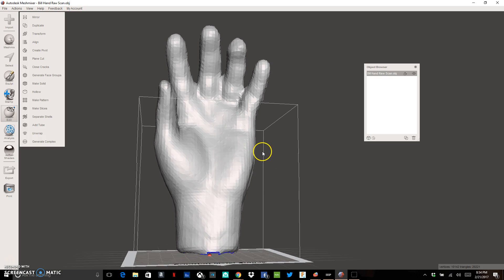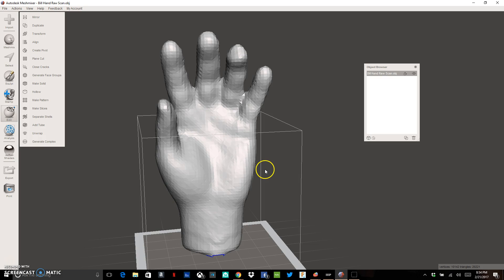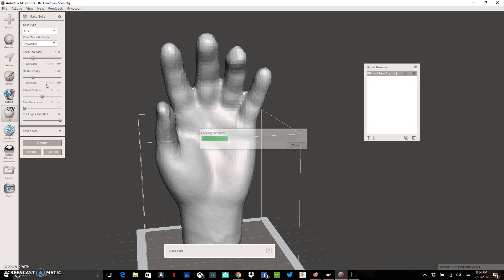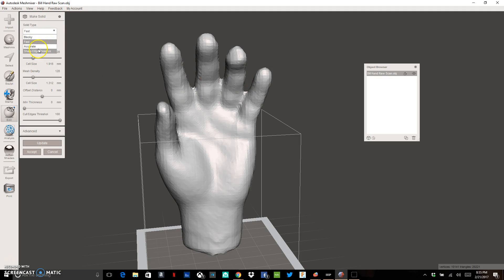What I want to do next is start cleaning and fixing up this file. The first thing we want to do with our 3D scan is close any cracks — just click on Close Cracks and if there were any cracks in this scan it would repair them for us. Then we want to make this file a complete solid. You can do the Fast option but it's a little blocky, so I want to get rid of that blockiness because it'll show up in your print. I'm going to go to Accurate and change my solid accuracy up to about 512.